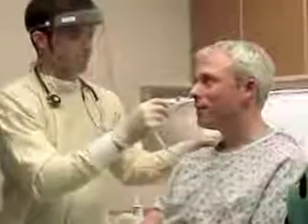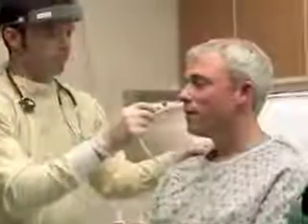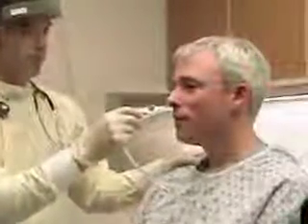Assure that the patient is in no respiratory distress and is able to speak. If the patient is unable to talk, is in respiratory distress, or if respirations can be heard through the tube, it should be removed immediately, as tracheal intubation has likely occurred.